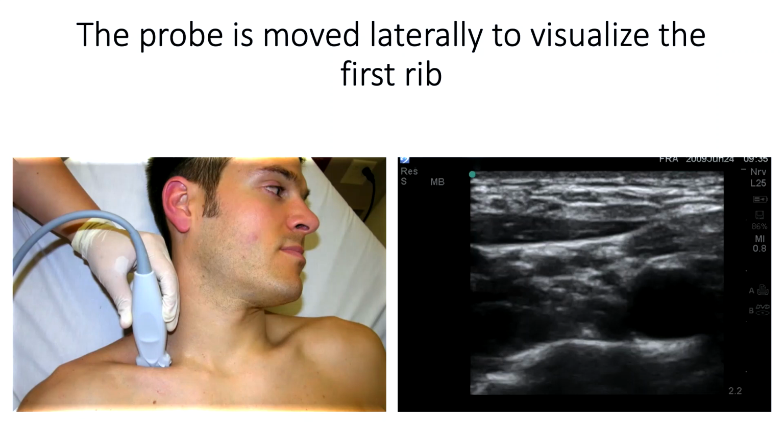And then the ones that are closer to the middle scalene will have to be posterior divisions, and the one in the upper corner will have to be the suprascapular nerve, because the suprascapular nerve happens to be the most lateral division, we call it, of the upper trunk. So you could then verify if this is indeed the suprascapular by just following the omohyoid and see if that nerve follows the omohyoid underneath on its way to the suprascapular notch. So you can actually just topographically get a pretty good educated guess as to what the nerves are.